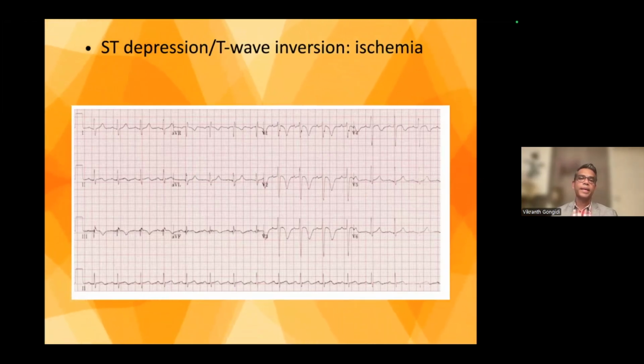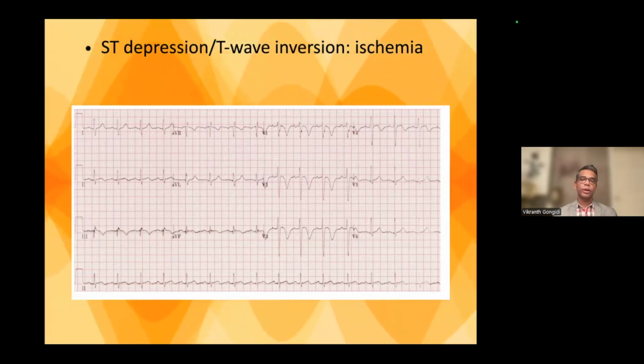So again, the basic thing is going back and remembering to set a pattern to however you read it and follow that pattern. Start with the basic demographics and follow through on your right to left pattern.